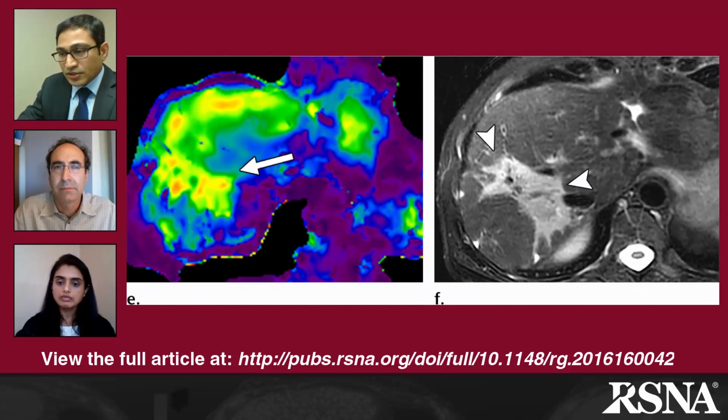Let's look at the third example, the one with figures E and F, showing a case of autoimmune hepatitis with confluent fibrosis. Now, if you look at the MR elastography stiffness map, the arrow points to an area of increased stiffness in one particular area. And this corresponds exactly to a hyperintensity on the T2 weighted images, which is a confluent fibrosis. This is exactly the region where there is a lot of fibrosis, and MR elastography exactly corresponds to that.